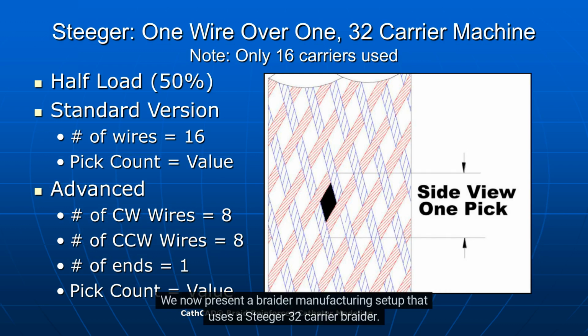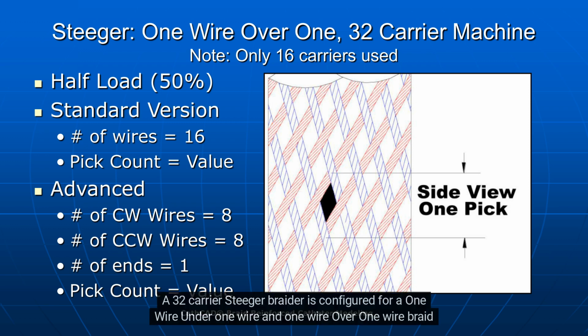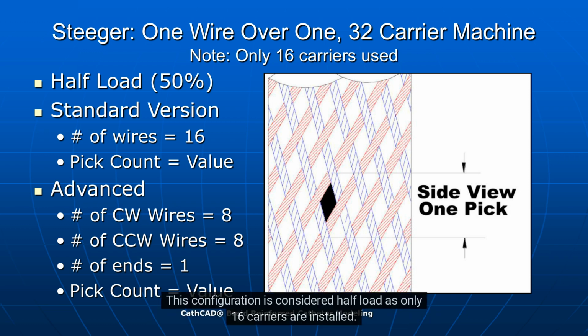We now present a braider manufacturing setup that uses a Steger 32 carrier braider. A 32 carrier Steger braider is configured for a 1-wire under 1 wire and 1-wire over 1 wire braid pattern. This configuration is considered half load as only 16 carriers are installed. The system will be running at 50% of the rated output speed.